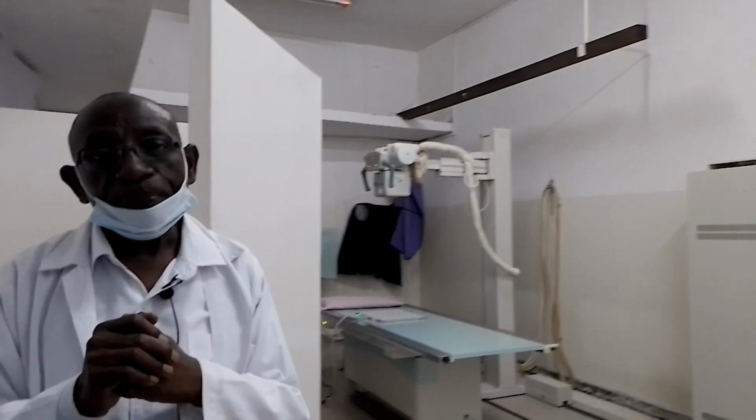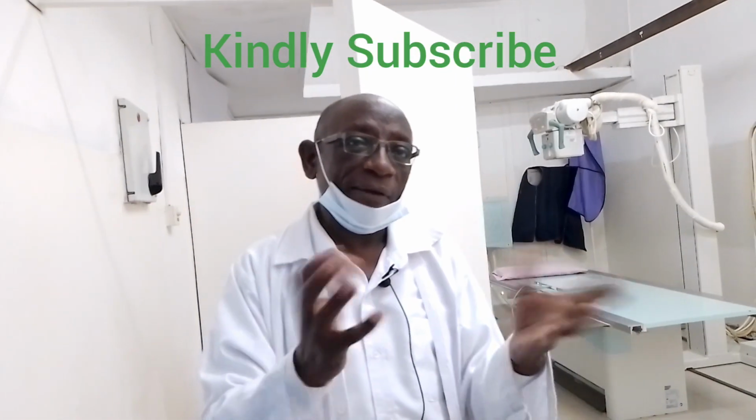So, what are the circumstances in which one would need to do an X-ray? Circumstances, in case maybe you had an accident, even an old accident. Sometimes you trip and then you have a fracture, or maybe you've been having chest problems, coughing, and you don't know what is happening. So you need an X-ray to check if it is pneumonia or whatever is affecting your chest. And the chest X-ray explains so much, either the infections of the lung or the size of the heart.